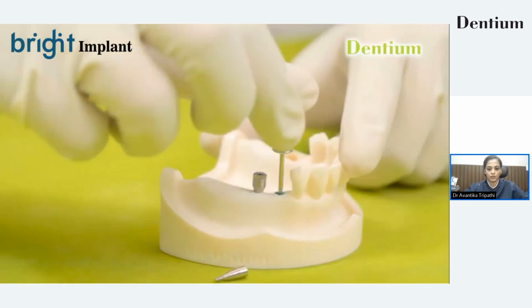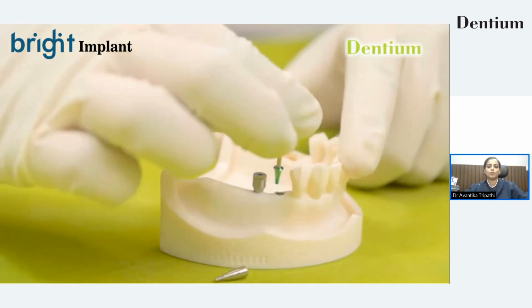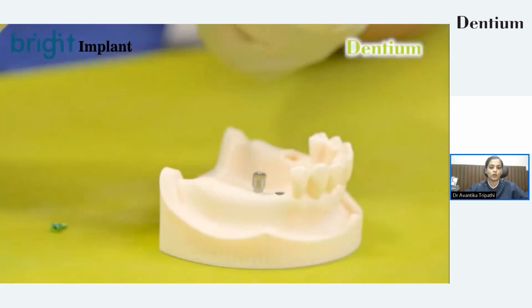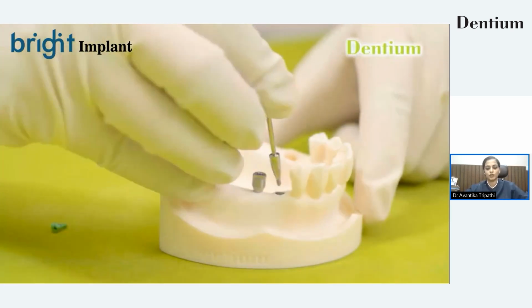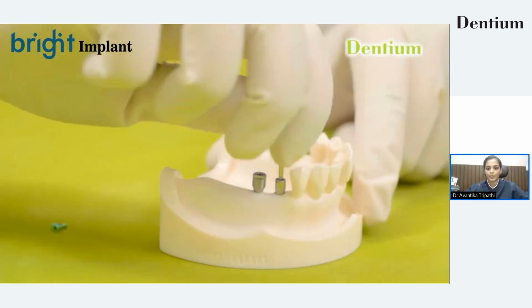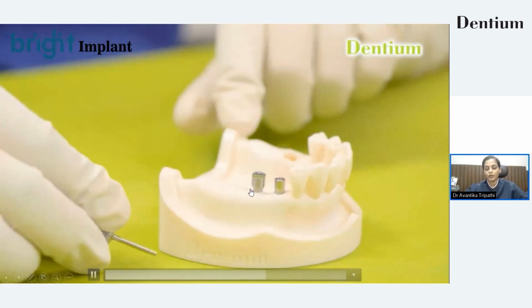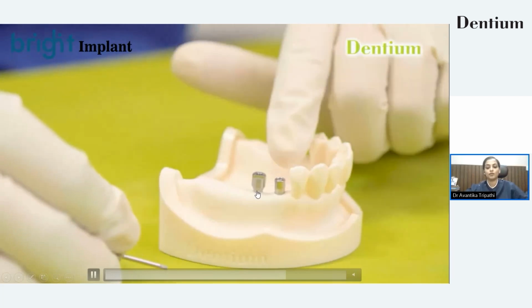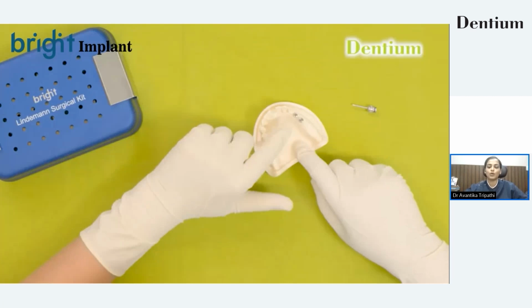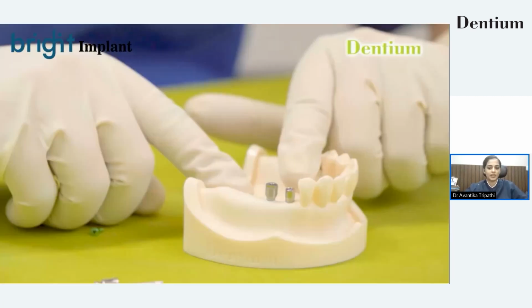We all know that we can do either a single stage surgery or a two-stage surgery. If I'm going to do a two-stage surgery, first I'm going to put a cover screw, close it with stitches, call my patient after 3 months, and then remove the cover screw and put a healing abutment on the top for the formation of a gingival collar. Adjacent to this bone level implant is a tissue level implant with a comfort cap on it. The tissue level implant with a comfort cap will look like a healing abutment. So we do not have to do a two-stage surgery in a tissue level implant, as we have already placed a healing abutment immediately after placement of the fixture.